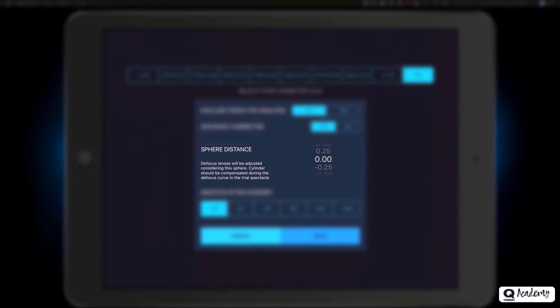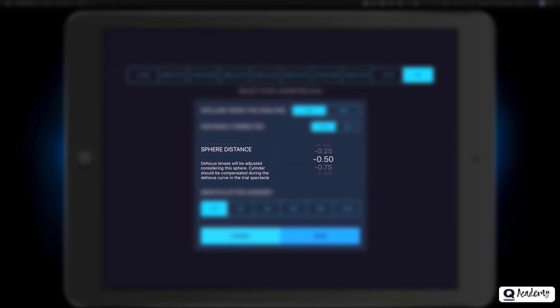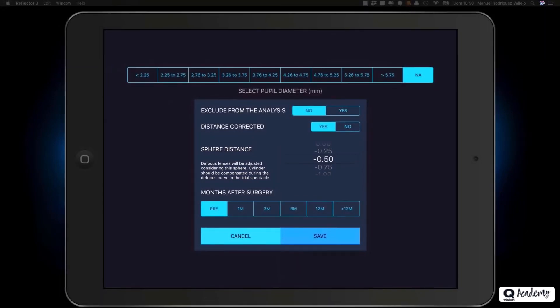If we choose yes, we will have to select the residual sphere that was obtained for the correction of the patient at infinity. This value shall be taken into account when establishing the value of the joint sphere, in order not to accumulate more than two trial lenses. Let us imagine that the patient has a residual of minus 0.50 diopters of sphere, minus 0.50 diopters of cylinder, at 90 degrees.